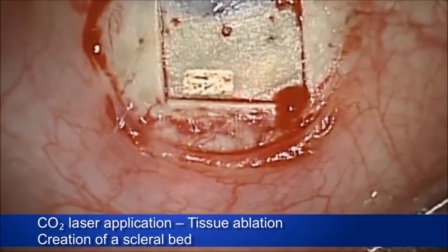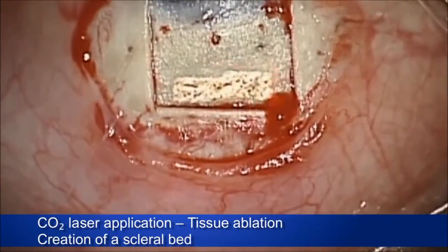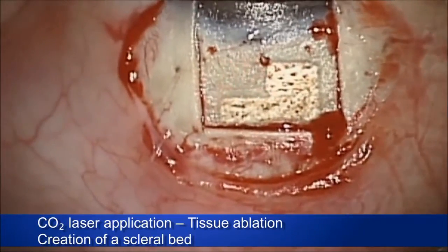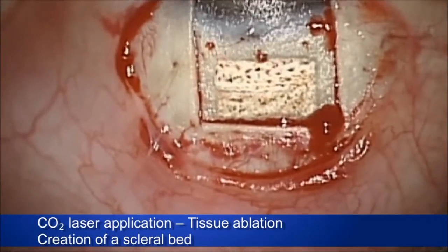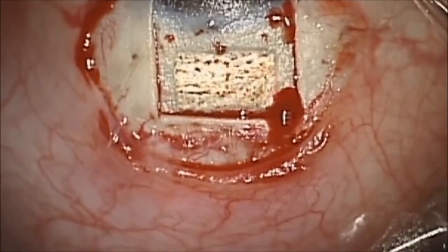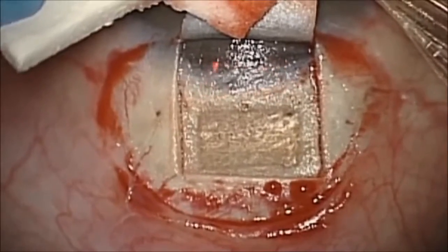The scleral flap should be created large enough in size. Here we recommend routinely using 5 by 5 millimeters in size, with a thickness of about 1/3 to 1/2. This is also commonly used for NPDS surgeries, and is adequate for the further creation of the scleral lake. Then we use the carbon dioxide laser to create the scleral lake. Theoretically, 4 by 2 millimeters will be enough, but for challenging cases, I recommend a scleral lake larger in size and deeper.